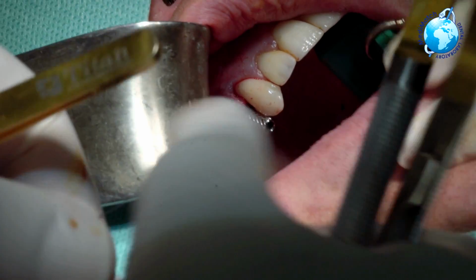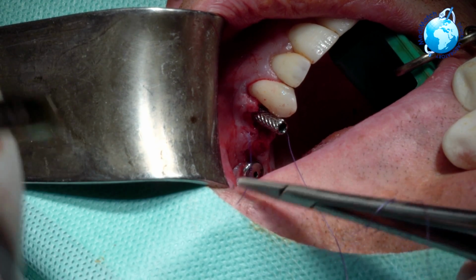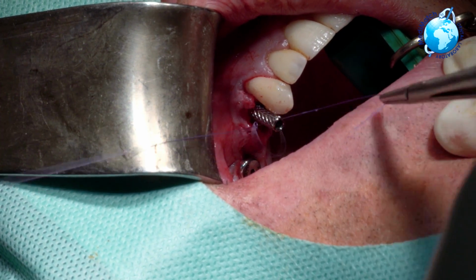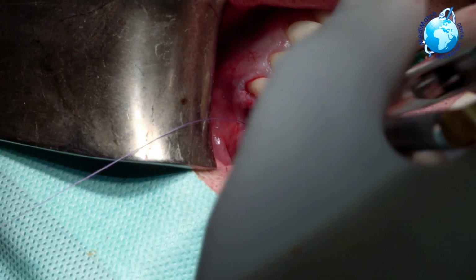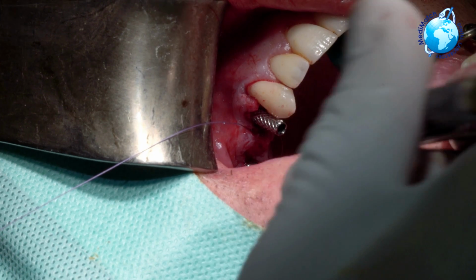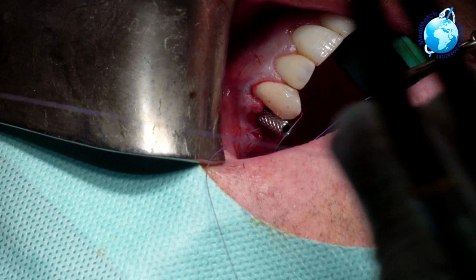The beauty of this material is no membrane, no faffing, and we've just done a beautiful sinus lift and two very solid implants. So Alan, I reckon these will be ready and cooked to completely restore in 5 to 6 weeks. It's literally the time. Okay there, Alan.